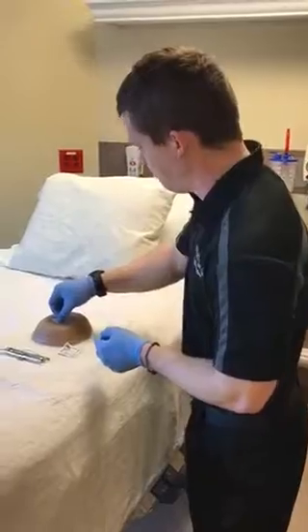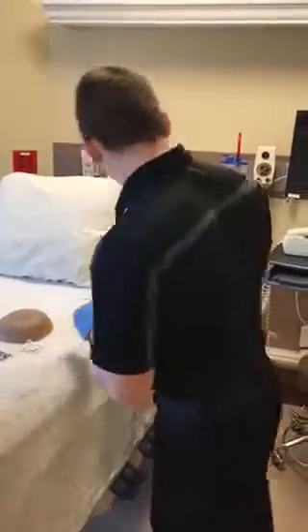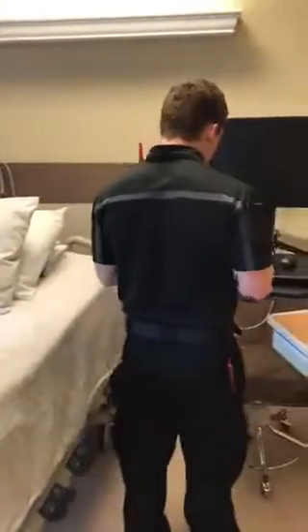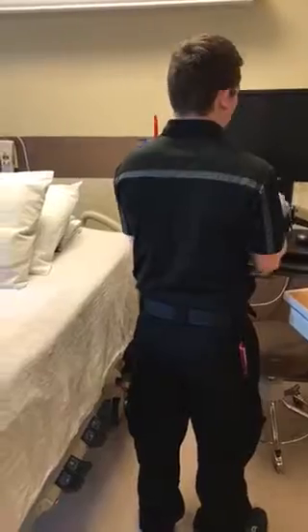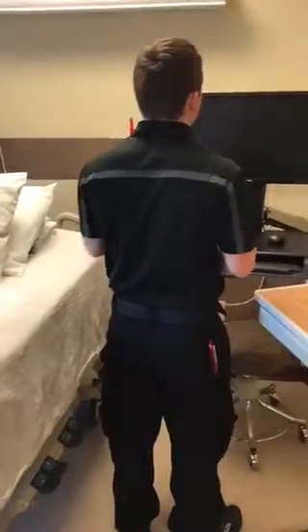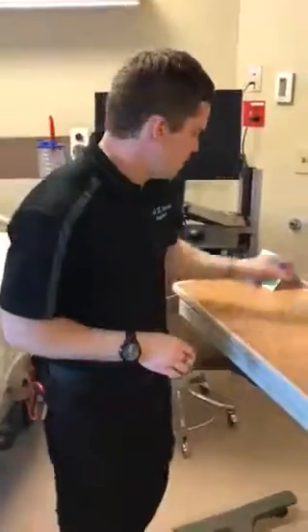How'd that feel, Bob? Oh, it was all right. All right. So then I'm going to document the location, which was the left deltoid. I'm going to document the amount, which was 0.5 milliliters, and the patient's response to it. Is there anything else I can do for you, Bob? No, that's all right. All right. We'll see you here in a little bit. Okay.